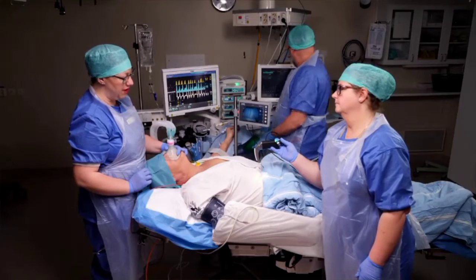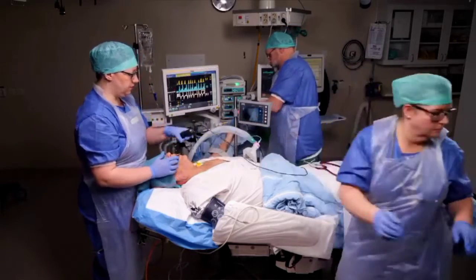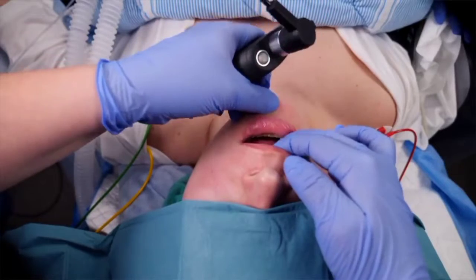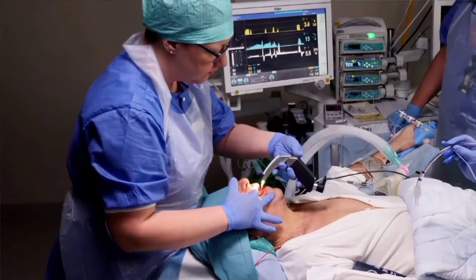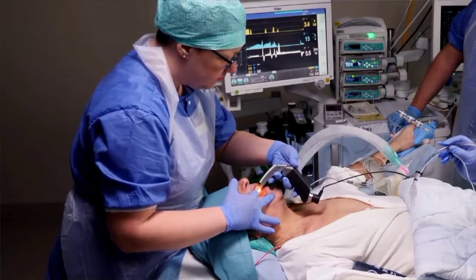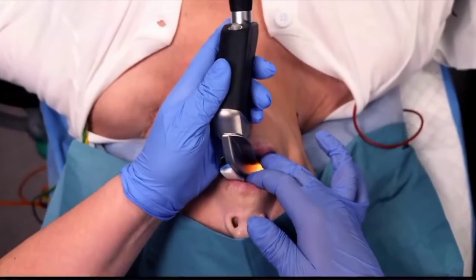Do not forget that while you may hold the blade, this is very much a team effort. Open the patient's mouth with your right hand and hold the laryngoscope in your left. Not too tight, with 3 or 4 fingers as close to the blade as possible for precision and control. Insert the blade in the right side of the mouth, carefully pushing the tongue aside.